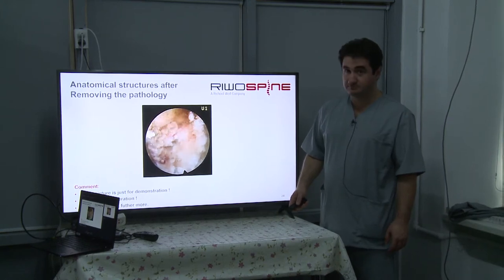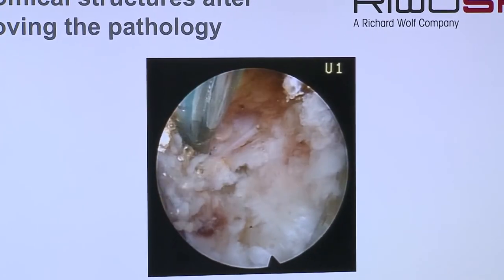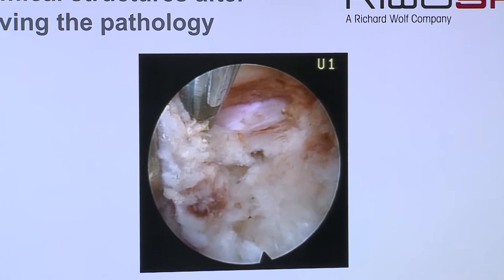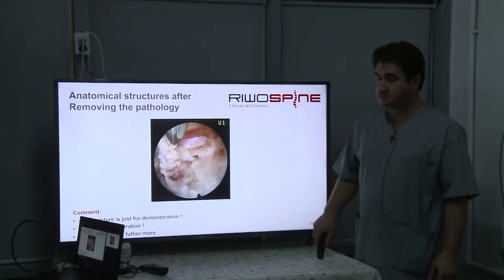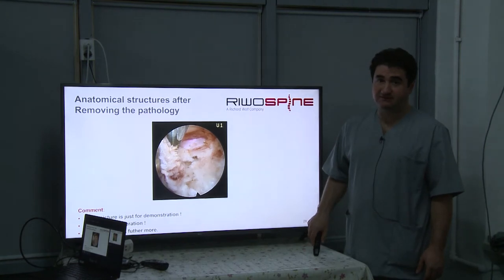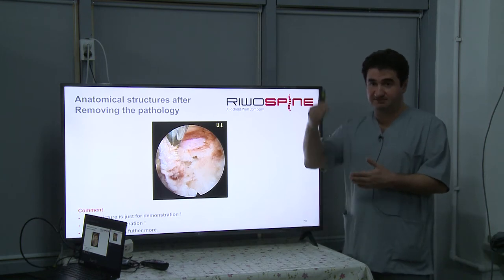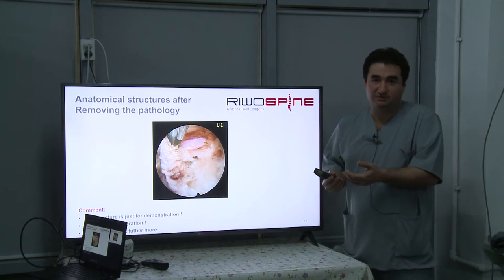Professor, how can we avoid damage to structures if we have an abnormal anatomy, for example, scoliosis? Then you have to correct your C-arm position accordingly. If we use a lateral approach with a 15 angle, we can avoid damaging the nerve and other structures. Is it right? Yeah, you have to care about the foramen size here. If there is a scoliosis, rotoscoliosis, you have to check the foramen size with the sagittal images first. If you see it is very narrow due to the scoliosis, then it's not good to do it transforaminally.